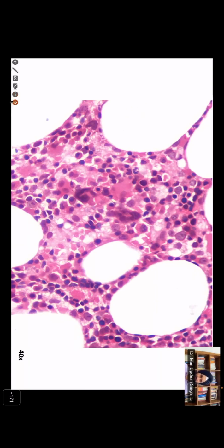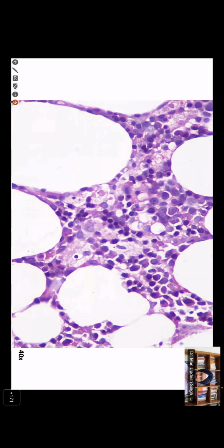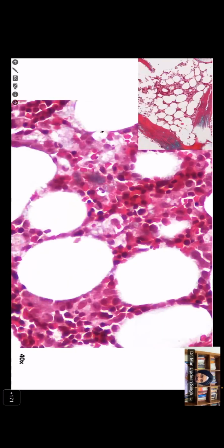Some stains can help at times. PAS stain brings out these vacuolated cytoplasm cells inside these histiocytes. Some fragments, more likely RBCs, inside. I might have another stain for you. That's Masson's trichrome actually. This is too red appearing, but sometimes it shows the histiocytes with RBCs prominently inside. So another stain, but PAS might be of help.